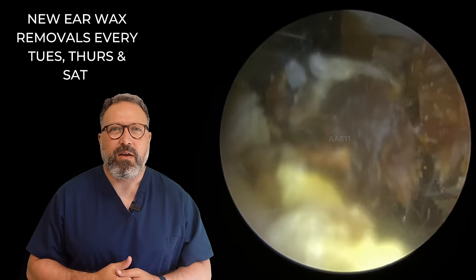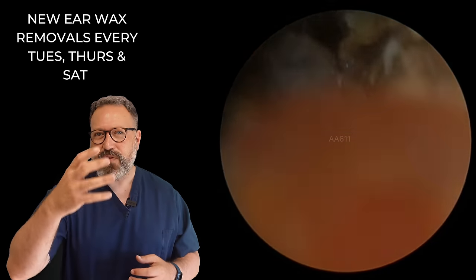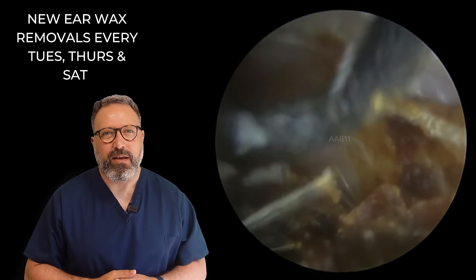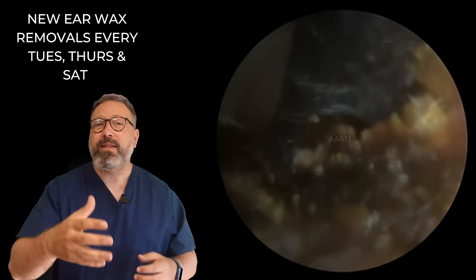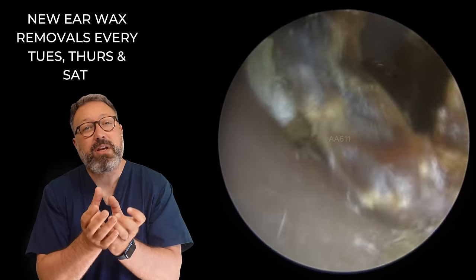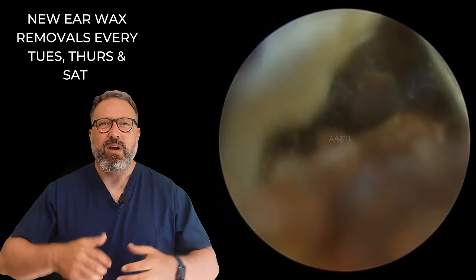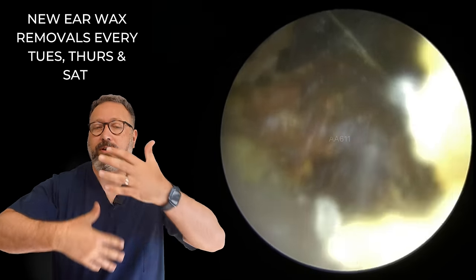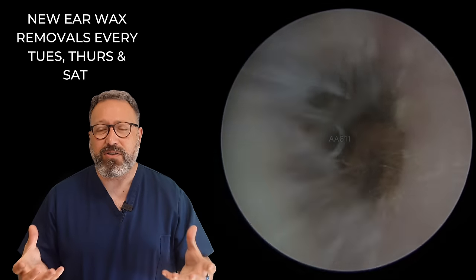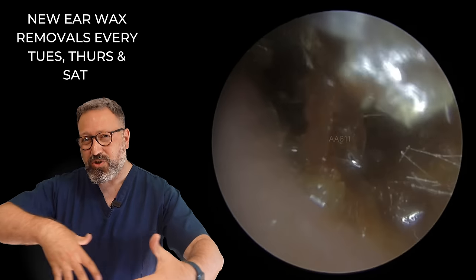You can see I'm just sneaking over the top, pulling this down. You can see it starting to break away — that very thick, sticky material in the center of this wax. When you look at the ear canals, you can understand why the outer part of that wax is as hard as it is — the ear canal walls themselves are quite dry, drying the outer section of the wax and hardening it up. Unfortunately with this plug, what we were hoping was going to happen with the Jobson Horn going behind was to roll the plug Indiana Jones style all the way down the ear canal wall. But because the center is so sticky and the outside parts are so hardened and stuck to the canal wall, as we try to roll, it's not actually rolling — it's just spreading and squishing the wax against the canal wall.